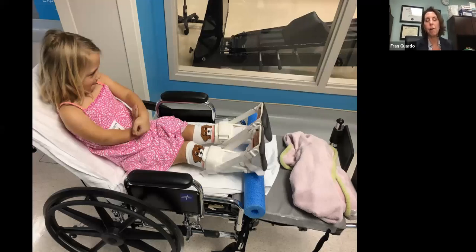This is an example of the wheelchair that reclines. We've got her reclined to 45 degrees. She's got a bolster, or rather a pool noodle, under her legs to help maintain that knee extension so that her hamstrings don't get too short. She's got dorsiflexion splints because she's undergoing a 4-segment lengthening with internal rods, by the way. So we've got her in a position that she's elongating her muscles even when she's at rest.